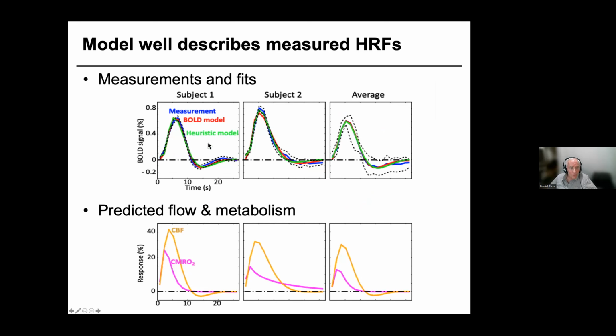We also use 2-to-1 k-space interpolation to keep the echo time down at 30 milliseconds, which will give us good functional contrast. And these were fairly high resolution measurements, 2 millimeter voxels. That's high for functional MRI. And the temporal resolution was, the sampling was 1¼ seconds, and 60 slices to cover pretty much the entire brain, at least all of cortex. We missed a little bit of cerebellum, but we're not that interested in cerebellum.